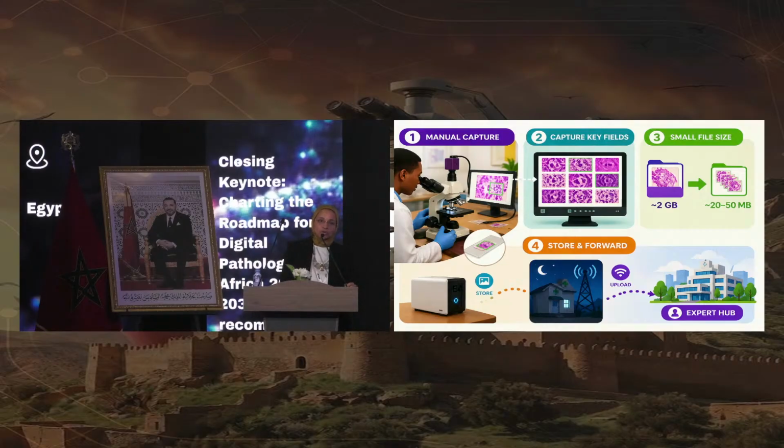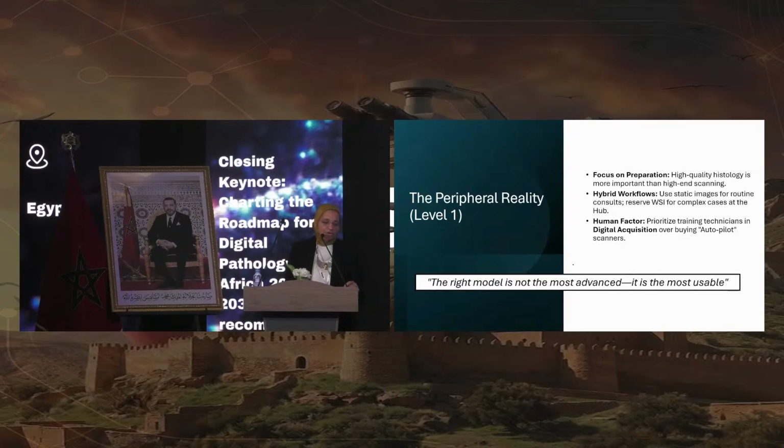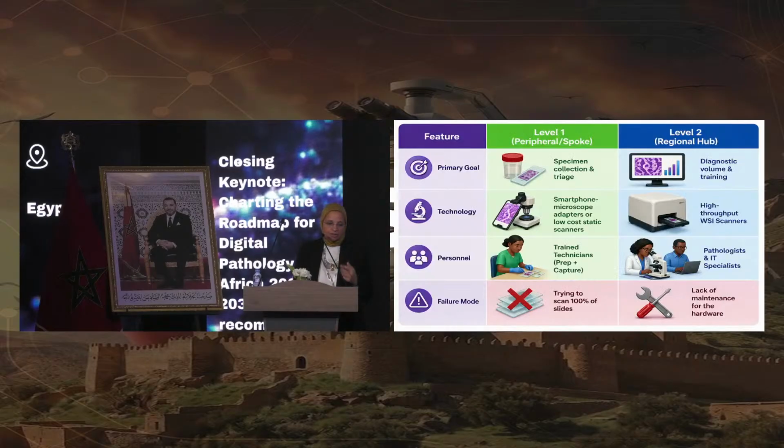Coming to the upload, it does not have to be a synchronous diagnostic setting. That is, we scan it and upload it now. No, we scan it, we keep it, we store it until the network is at its perfect strength, which is most probably at night. We will do this asynchronously. There are solutions to navigate us through. Then, the right model is not the most advanced, it's the most usable, the one that answers our questions.